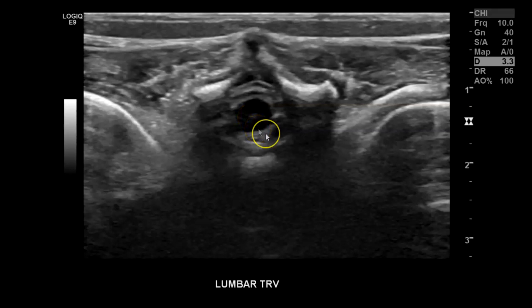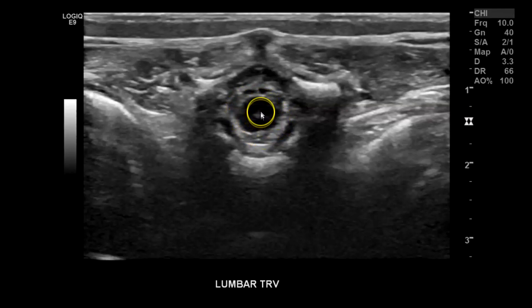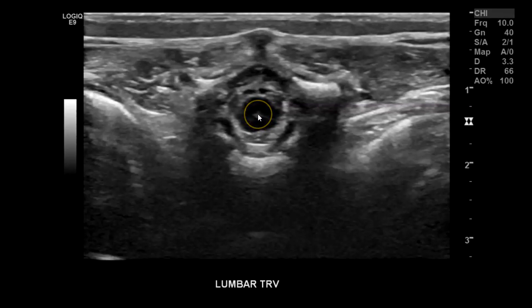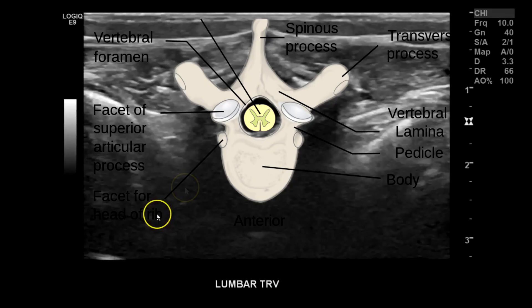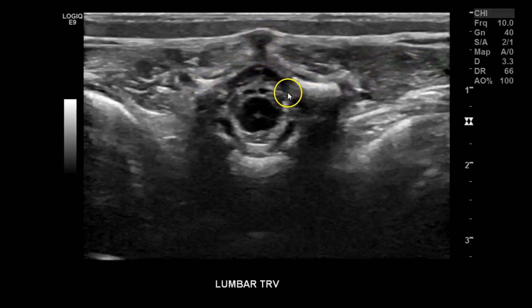I begin transverse in the lumbar region — you can go back down to the sacrum and work your way up, but I'm already in the lumbar region. You can see the spinal cord in transverse very clearly, including the central canal. This is good to look at because you can have dilation of it, which is referred to as hydromyelia. At the very end of the spinal cord where it starts to taper into the conus medullaris, you can have a small dilatation termed ventriculus terminalis. In this transverse view you can see the spinal canal, cerebrospinal fluid, the vertebral body, lungs, muscles, the spinous process, the lamina, and the transverse process of the spine.